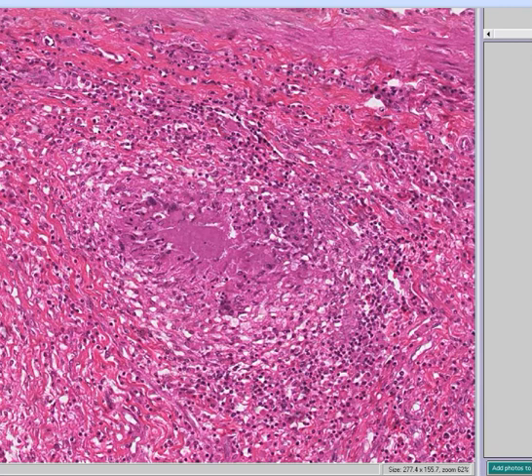Last case we are done with. Let's go to a couple liver cases now. The most important liver slide I want to show you is slide number... I hope it's here. Yeah, this is the most important liver slide I want to show you right here. In fact, I'm going to blow it up right away, so when you see it, it's already going to be blown up relatively nicely.